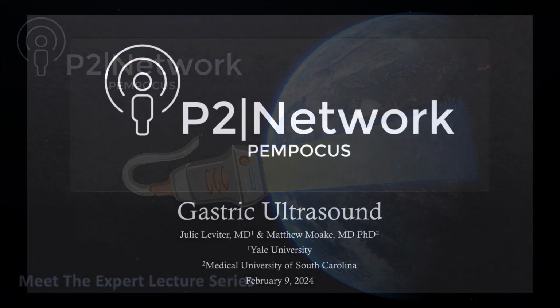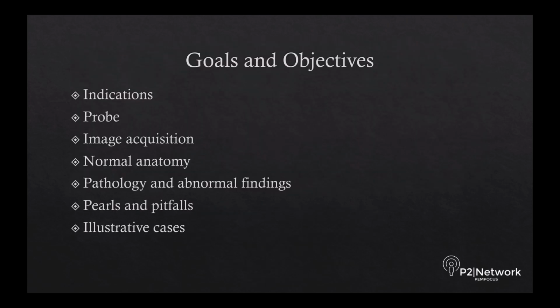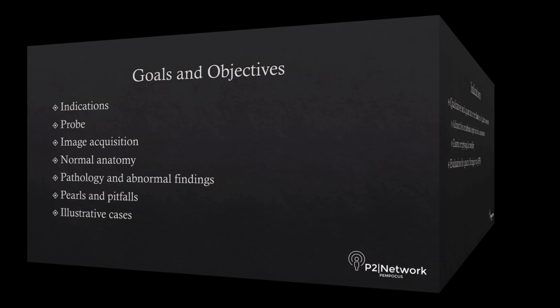Hello, my name is Matthew Moake, and together with my colleague Julie Leviter, today we're going to talk about gastric ultrasound. The goals and objectives for today's talk are to review the indications and probe selection to perform this exam, touch on the technique for image acquisition, review the normal anatomy, pathology and abnormal findings, review a few pearls and pitfalls, and discuss some illustrative cases that you could use this technique for.